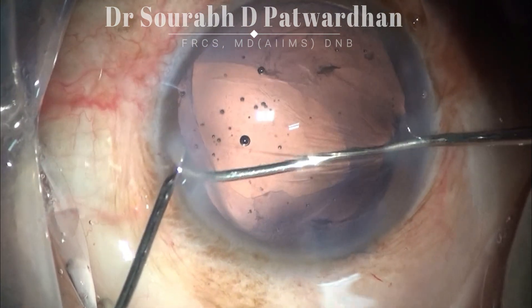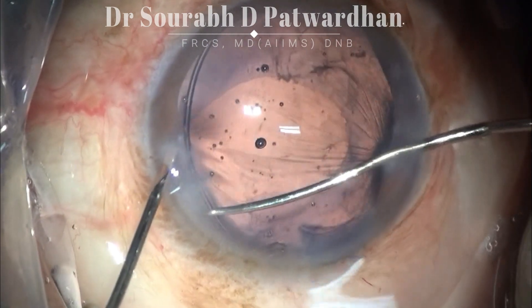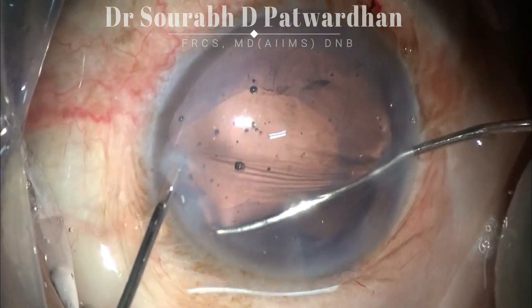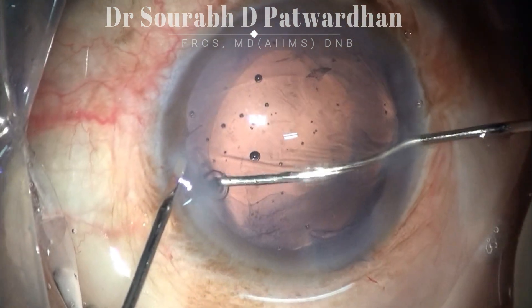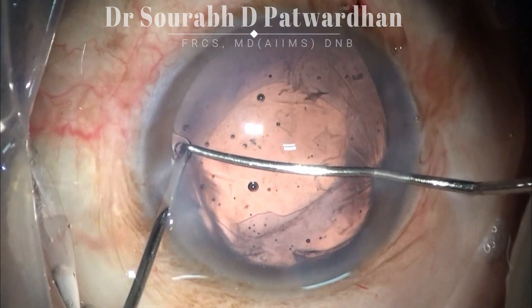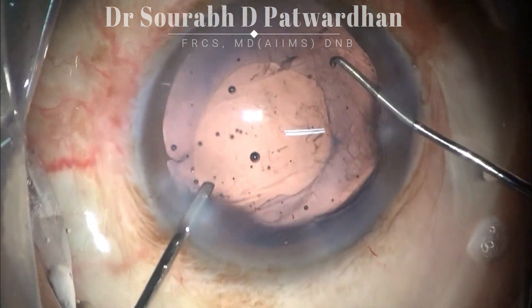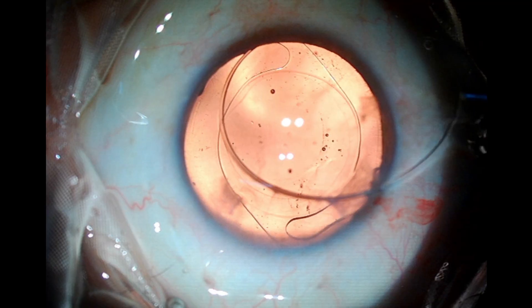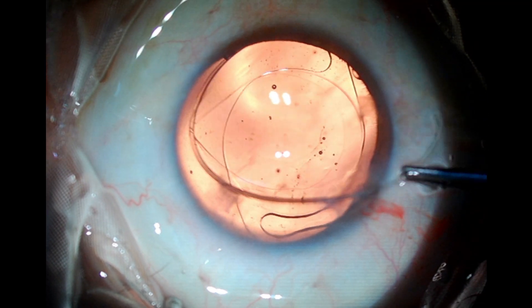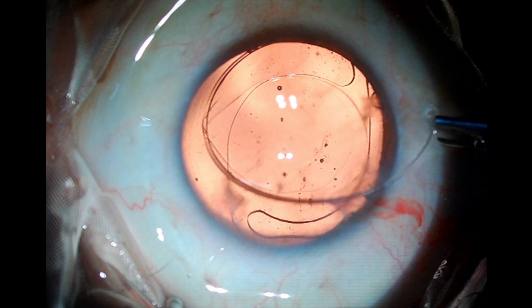As you can see as I keep rotating it, the eyelet can be seen and then I rotate it inside the bag. To avoid this complication, you can support the CTR using a second instrument in your non-dominant hand so that you can nudge it into the bag while inserting, or it is better to use a forceps or a CTR injector.